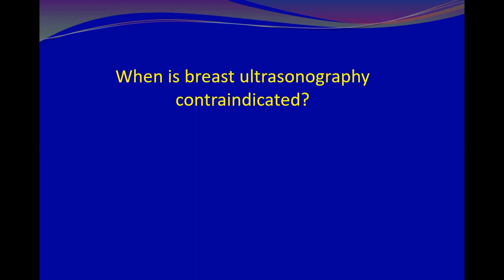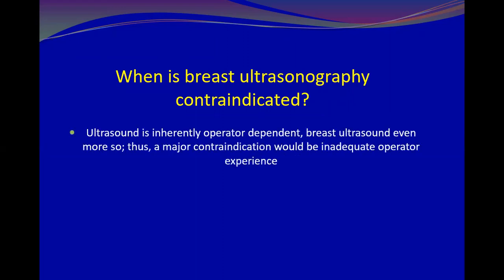According to the previous examples, could you imagine when breast ultrasound is contraindicated? No contraindication.